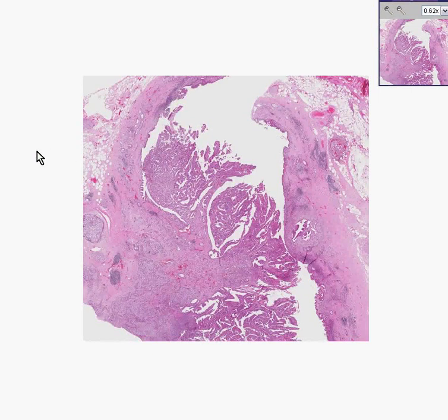Here is a case that is not rare in nature, but it's rare for us to get such a beautiful view of it. This whole thing out here looks like a large duct, doesn't it? It's because it is a large duct. It is an extrahepatic bile duct. It looks a little bit too large to be a left or a right bile duct.